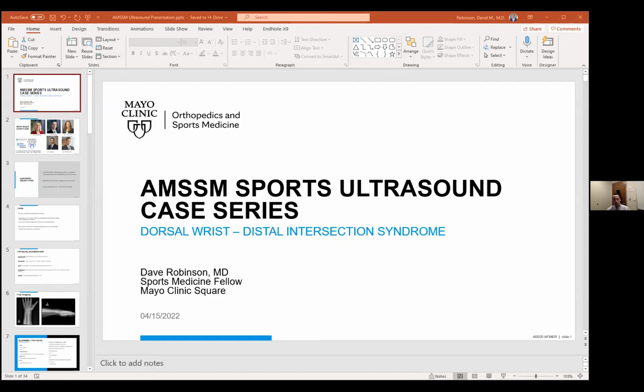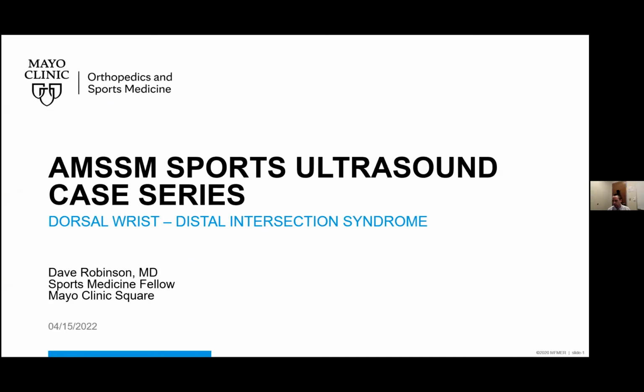Okay. So thanks, Dr. Cruz, Dr. Hoffman, AMSSM for the opportunity here. Like Dr. Cruz had mentioned, we'll be talking about distal intersection syndrome. And it's really kind of an overview of the complete diagnostic scan of the dorsal wrist.